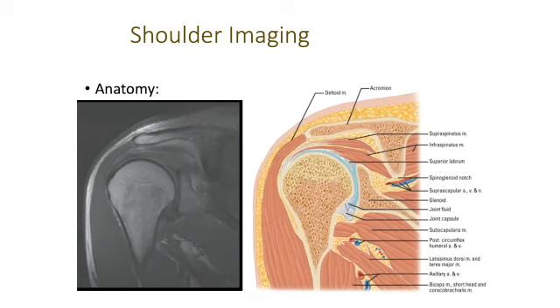So taking a look at the anatomy, make sure you're familiar with the anatomy that we can see in each of these views. My suggestion is definitely try to blind the answers and try to pick out and identify these. Like I said, we're going to do some more Blackboard Collaborate sessions where we're going to do a lot of labeling, and I want to make sure that you guys are very familiar and comfortable with how to label an MRI.